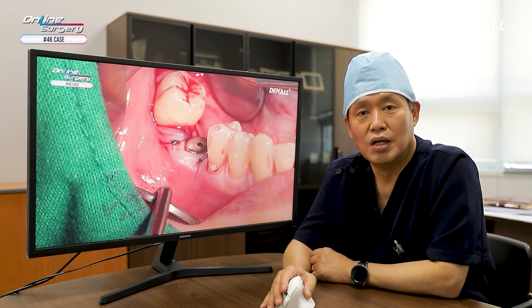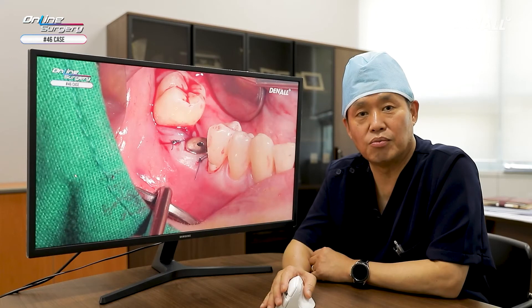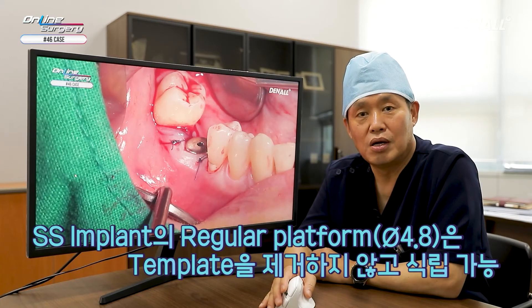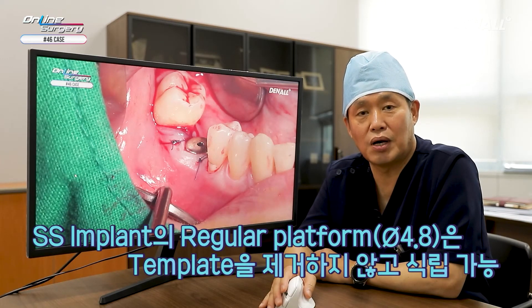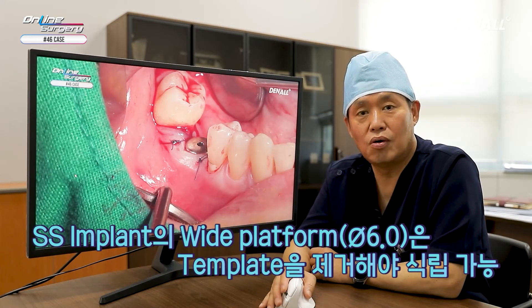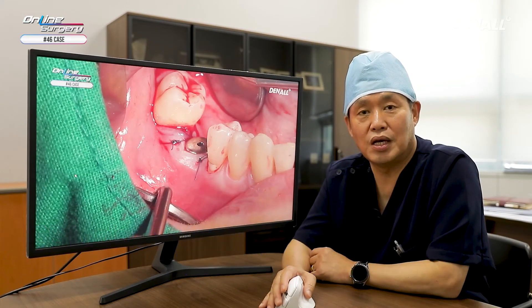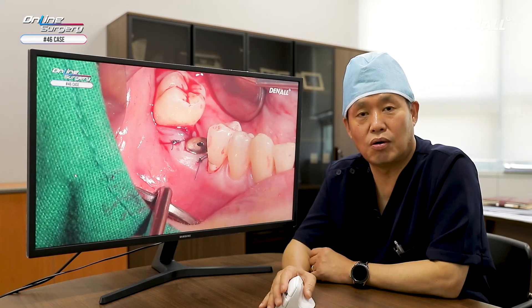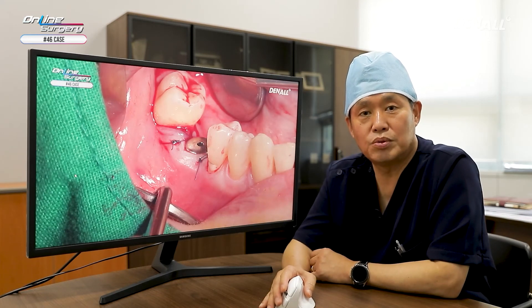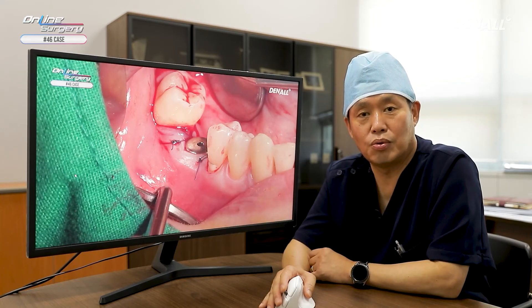I used the SS type implant. In the case of a wide one guide template hole — which is 5.8 — if you want to use regular platform, which is 4.8, you can use it for implant placement. However, I chose wide platform, and therefore the template was removed and the implant was placed, as shown in this video clip. When you use a one guide template, you can use SS type along with TS type and also use wide platform. In those cases, after removing the template, you can place the implant. That was shown in this video.